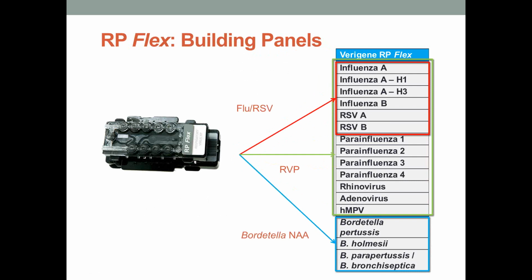So we saw the physician feedback that they wanted the flu and RSV. Then we saw the next step is really that comprehensive panel rather than breaking it into multiple different options because of the overlapping symptoms and seasonality of respiratory viruses, and because of our really vulnerable population, we felt like if it wasn't flu RSV, we needed to be able to see the whole panel.